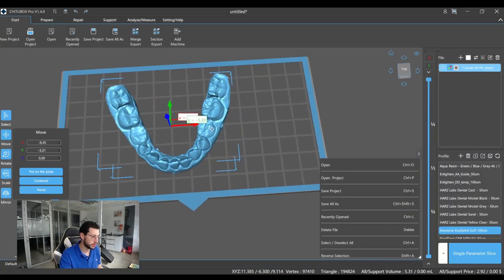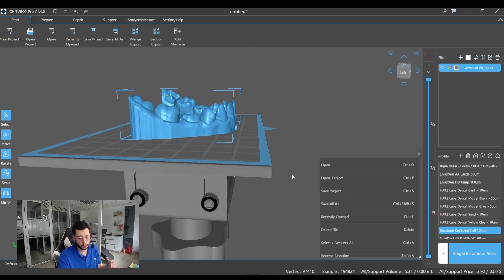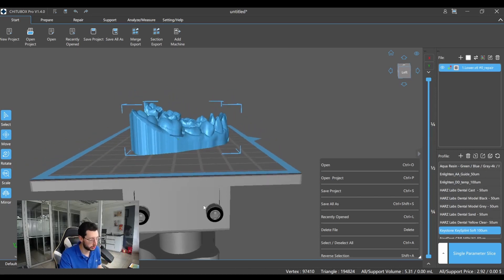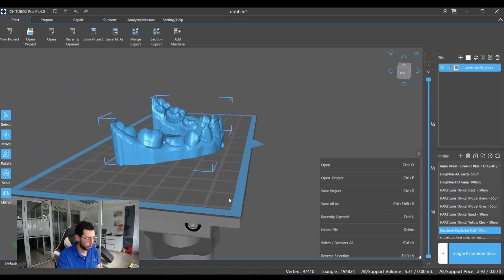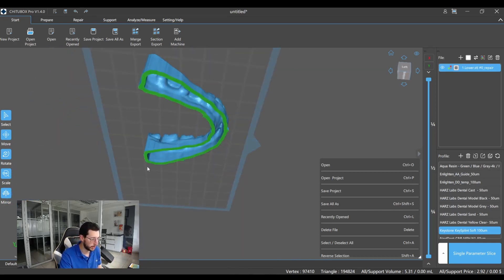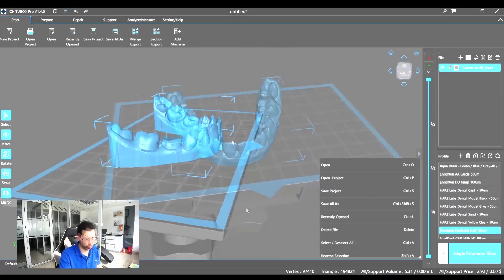The first thing you have to decide is which orientation you're gonna use. As I said before, this is one of the main keys for failure. My recommendation is to print it like this — horizontal. Because this is gonna give us a big piece of resin stuck to the platform, and that will prevent some problems later on.